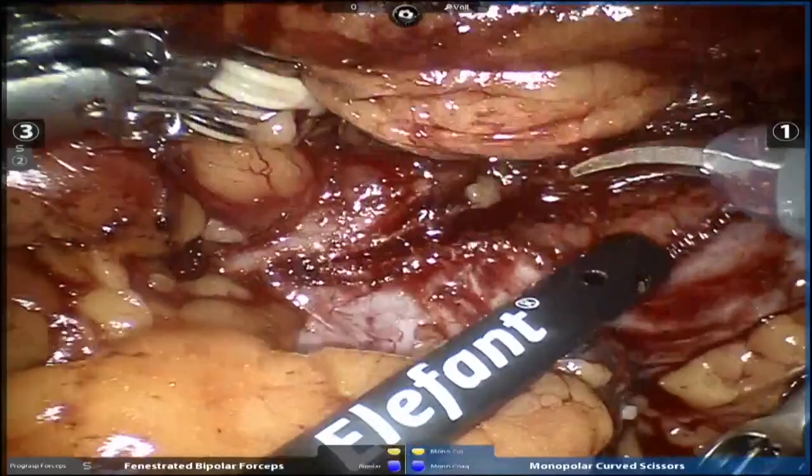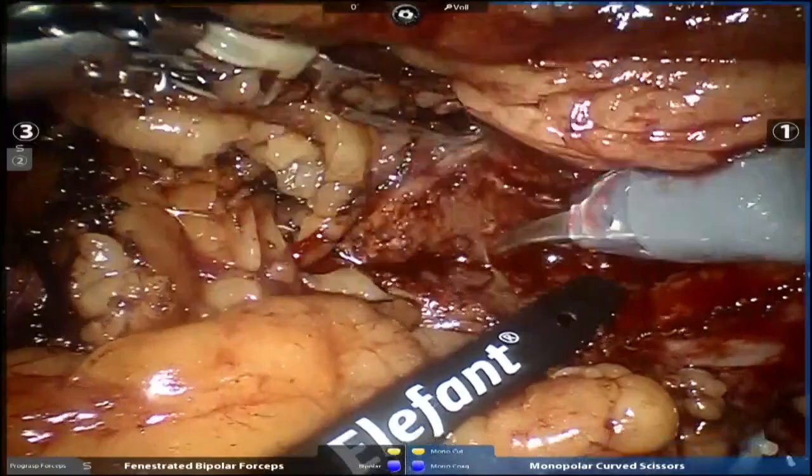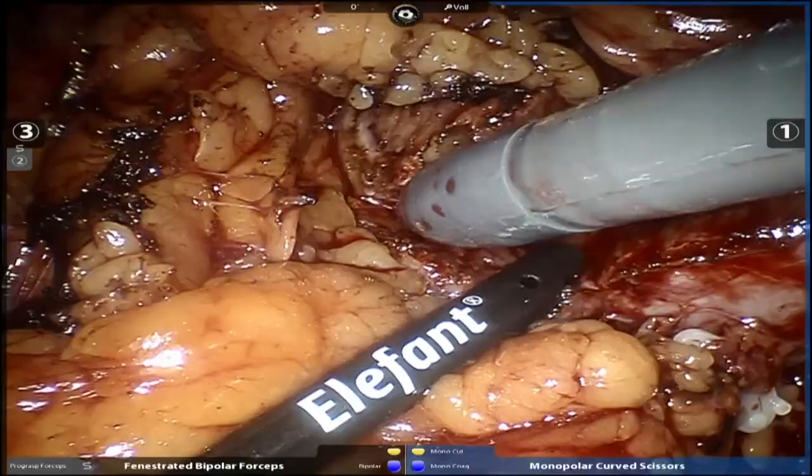But still, to come back to my former question, this is not enucleation, but you cut in the normal tissue. So this is a segmental excision.